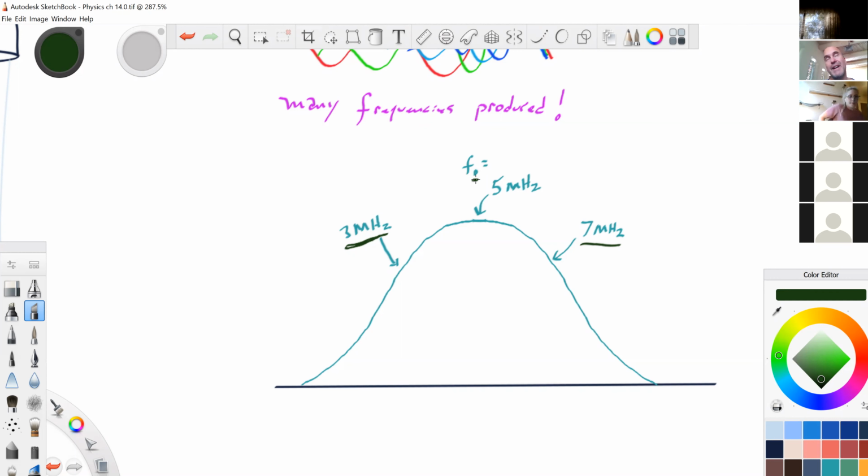Well, with dynamic frequency tuning, this is back in the receiver, not so much the transducer. The receiver says, okay, I recognize these voltages, which used to be sound echoes, but were converted into a voltage by the piezoelectric element. It goes back to the receiver. The voltages are at 3 megahertz and 5 megahertz and 7 megahertz. And so it can recognize, oh okay, I see what's going on. There must have been different frequencies going in. That's why I'm getting different frequencies coming out.